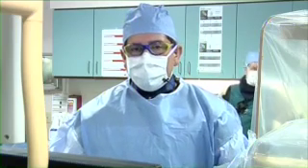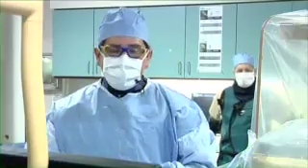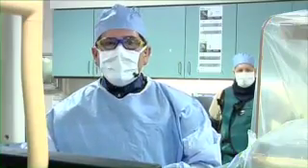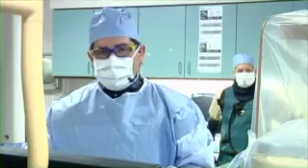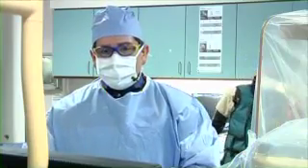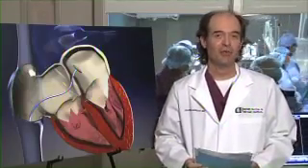The patient has a high risk because there is an opening, like this patient. This patient had a floppy septum. She had a wide open patent foramen ovale. The bubbles crossed very easily from one side to the other. She already had 2 events, and she's 29 years old. So what are you going to do? That's the patient. What we're going to do is what you're doing today, closing the PFO, the defect there.